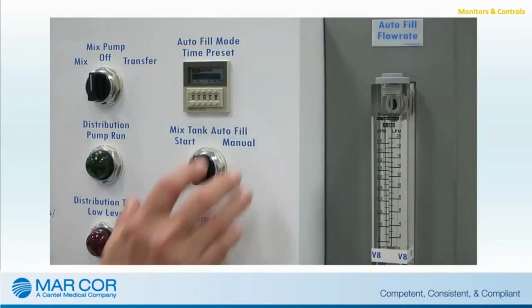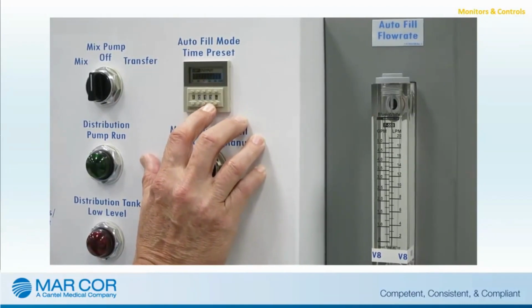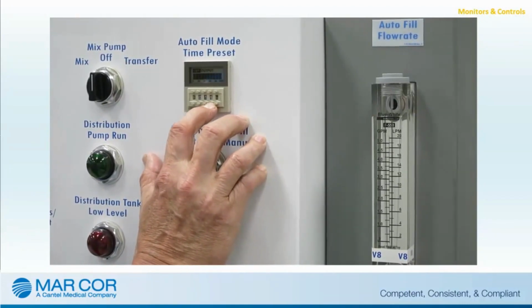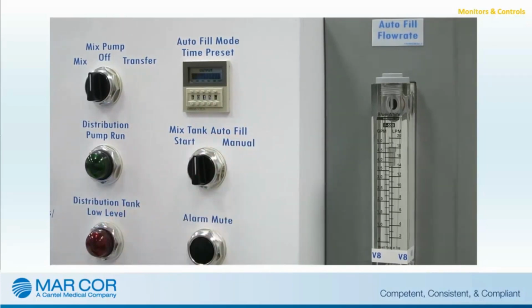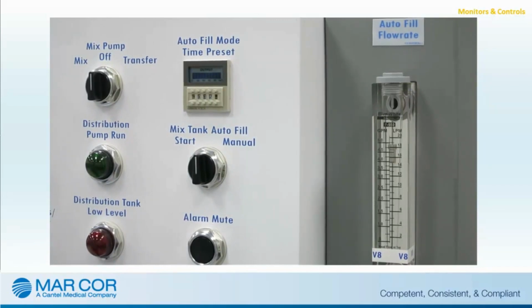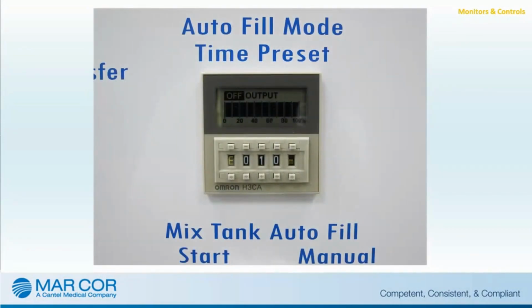The autofill mode timer is used along with the mix tank autofill switch and inlet water solenoid to fill the mix tank for a predetermined amount of time. The time setting will control the duration the inlet water solenoid opens to supply the mix tank with water. The timer mode must be set to the E and M for minutes settings with the user adjustable time settings.